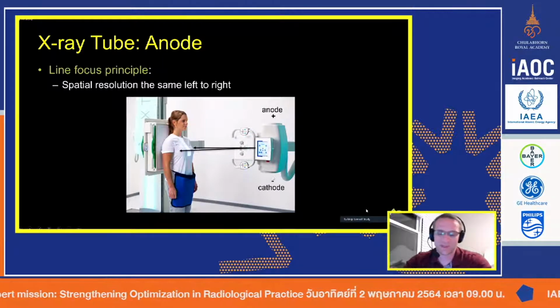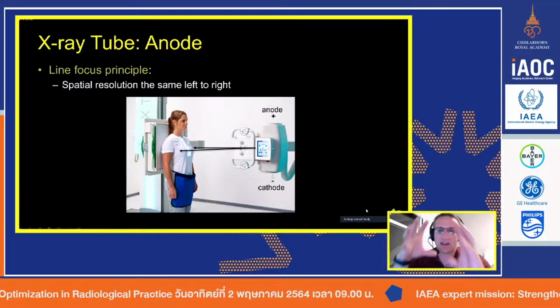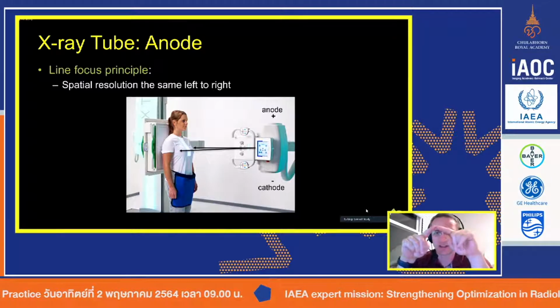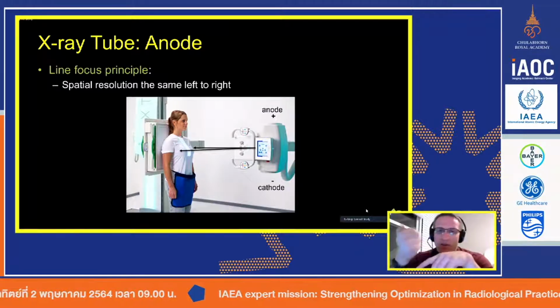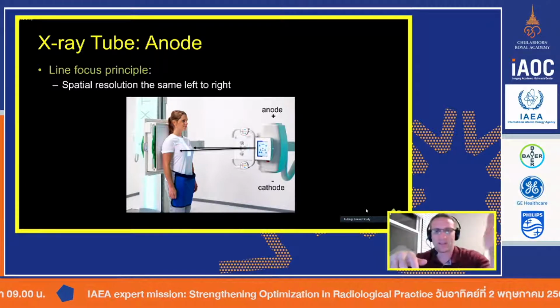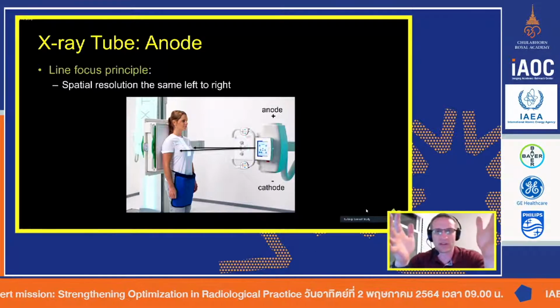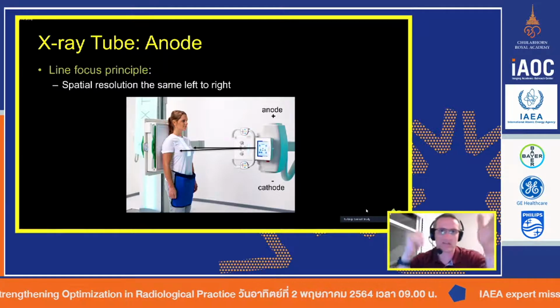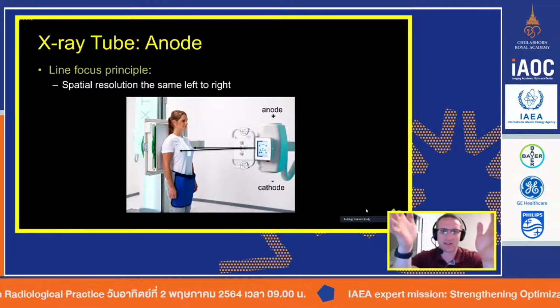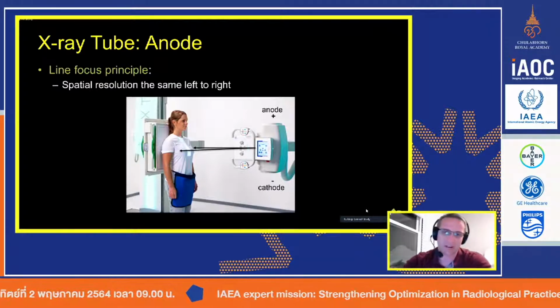But the trick I always use, if it's an older system and it doesn't tell me which side is the plus side or the anode, and which side is the negative, is to acquire 5 or 6 X-rays and put your hand on the side of it. The side of the cathode will be cooler than the side of the anode. The anode, the target side, is obviously going to be the hottest side because that's where all the electrons are striking. So if you put your hand on one side and it's cold, that's the cathode side, and you put your hand on the other side and it's hot, then you know that's the anode side.